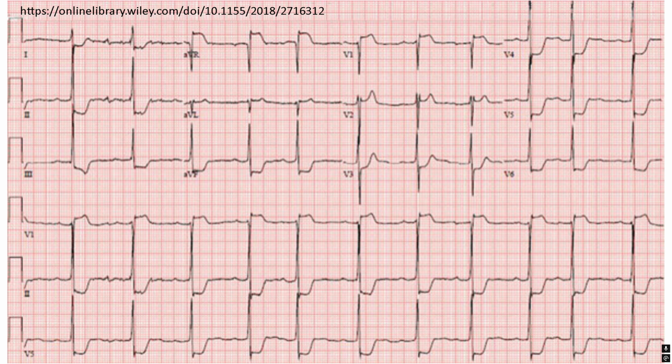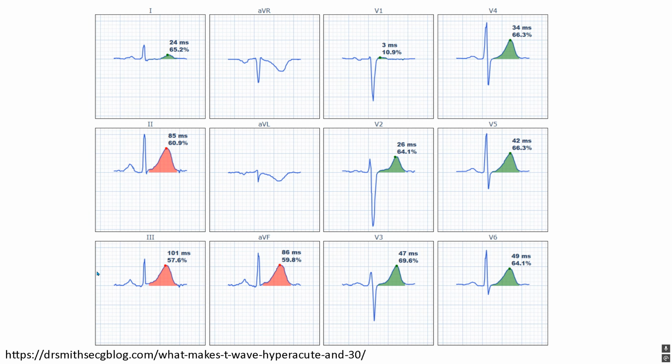And when I compare this to normal, you're not supposed to see J-point deviation in those leads and or T-wave inversion leads, so it's abnormal. Okay. Here's an example of hyperacute T waves. Now, hyperacute T waves are more tricky because it's more subjective. Okay. Here's some fancy nerd math science stuff where they're defining hyperacute T waves based on their increased area, which I think is dope, right? Because if you get straightening of the ST segment, that'll increase your area. And if you get J-point elevation, that'll also increase your area.